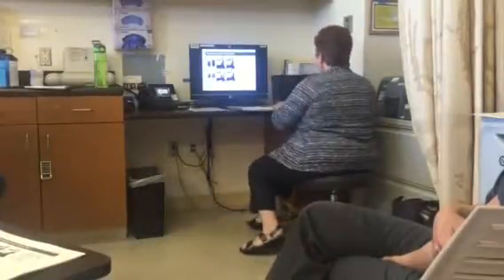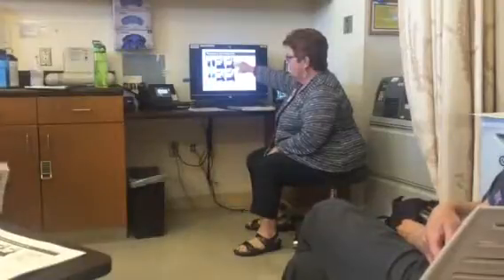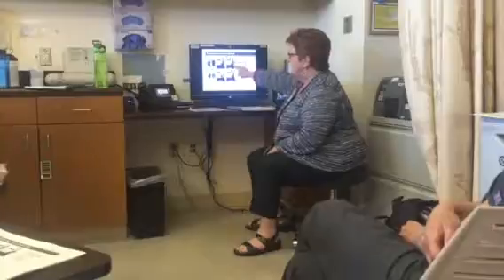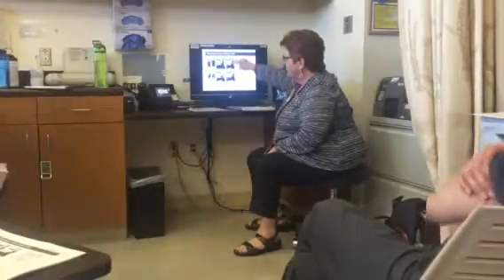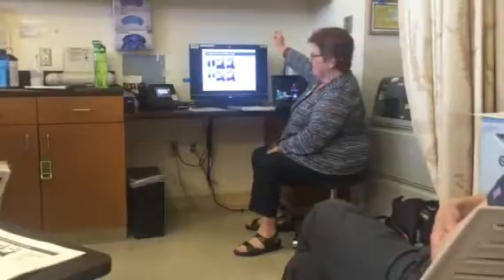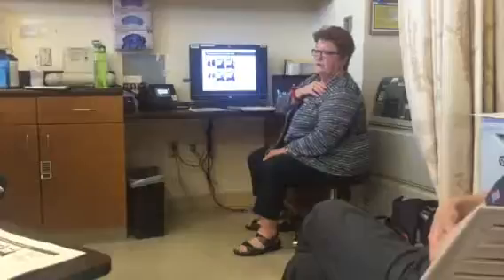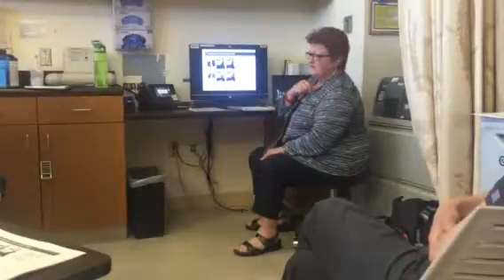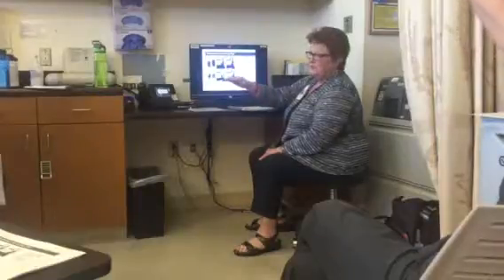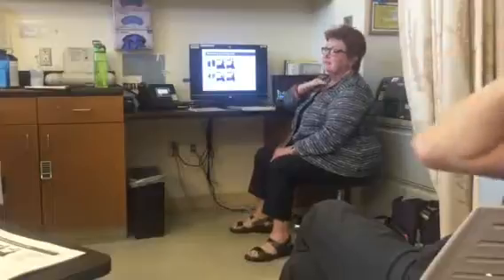But you can see interface. So here's your collect port. Here's that black backwards L that I pointed out in the filler. This is where Optia is locking onto the collect port image to show you the concentration of cells coming up the collect port. What should the interface look like? Smooth as glass. The interface, not the collect port. The interface should be as smooth as glass. I have said that over and over until I'm sick of hearing myself say it. But it's got to be smooth.